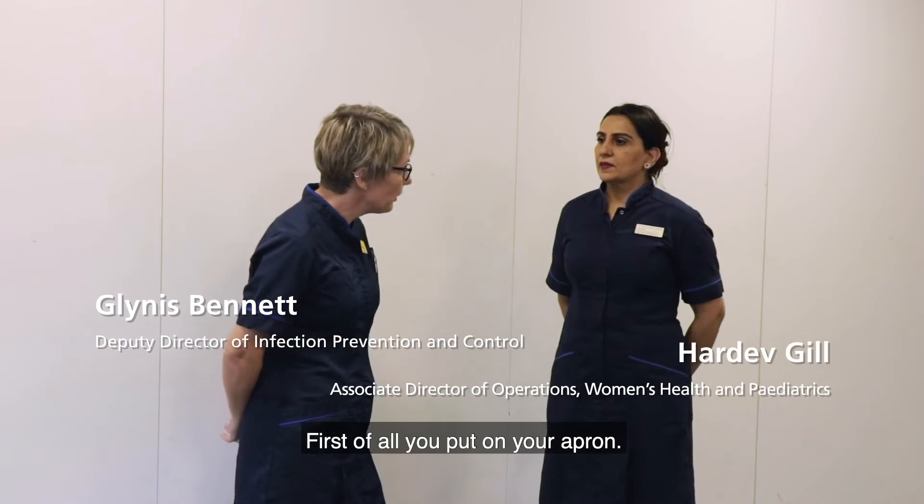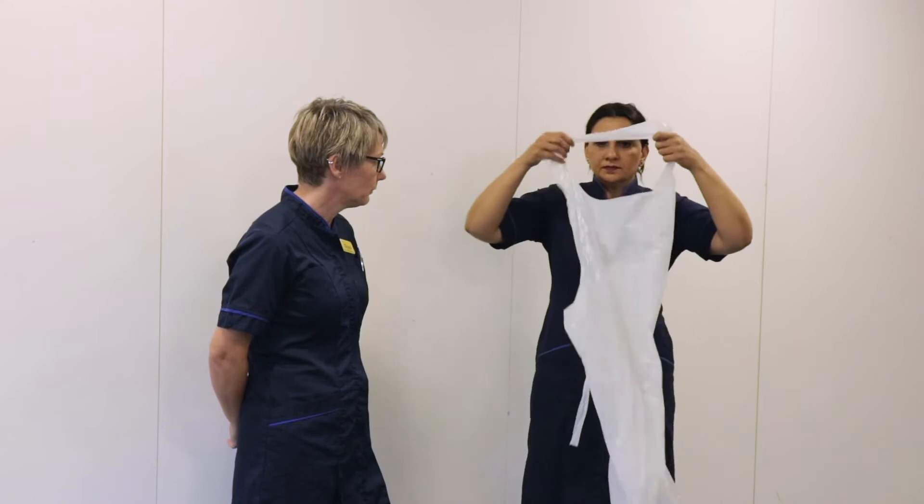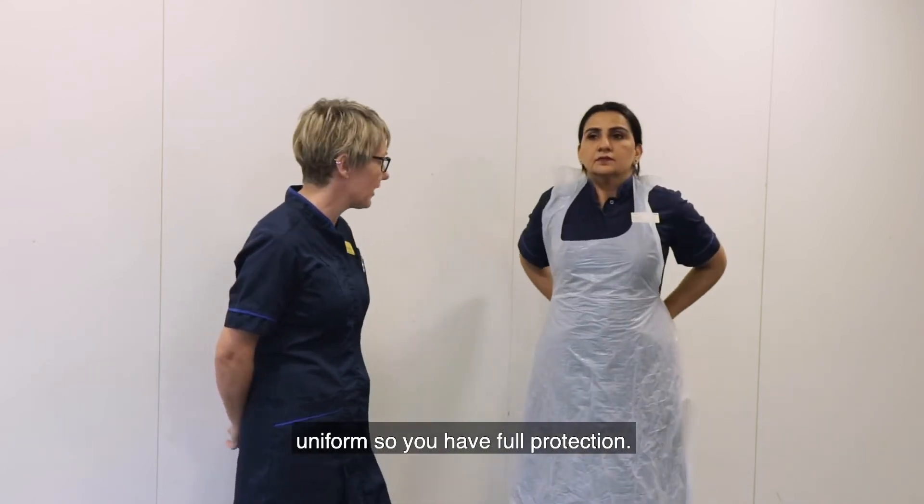First of all, you put on your apron. Please make sure it's securely fastened and covers your uniform so you have full protection.